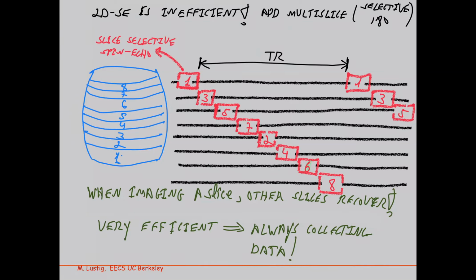Because their slice select might not be perfect and it might excite other spins. Very nice. Yeah, absolutely. So what happens is, first of all, the selectivity, remember, it's with whatever time bandwidth you pick. So it could affect slice 2. And if I excited slice 2, now it's going to hurt its signal. So if I excite slice 1, 3, 5, 7, by the time I reach slice 2 again, these spins have time to recover.